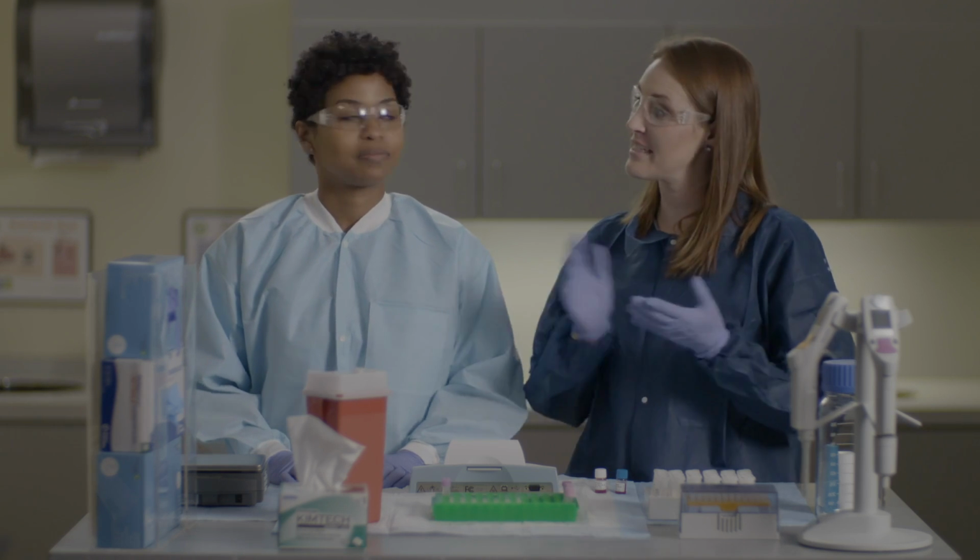And that's it, really. Once you get your sample, it's just a matter of labeling and storing it properly and sending it to the lab. It's a lot of work, isn't it? Having this lower reference level. Well, it's probably best to be cautious.